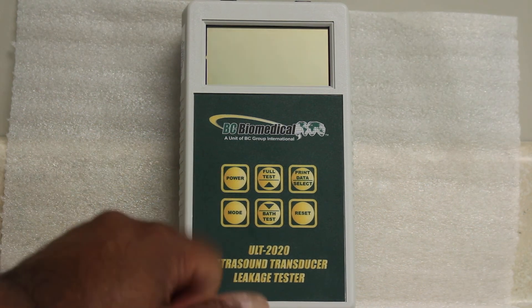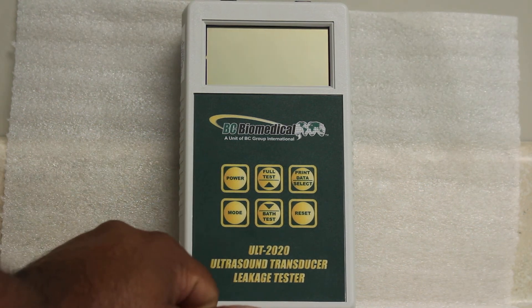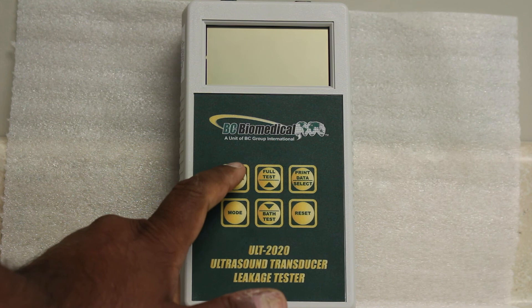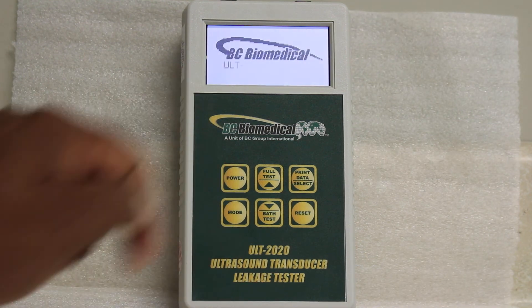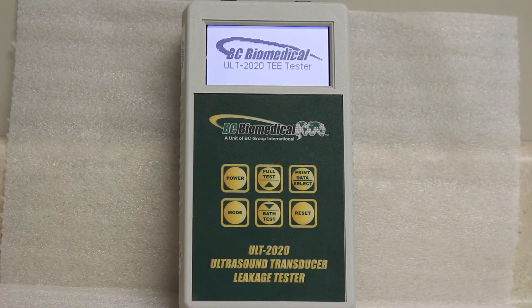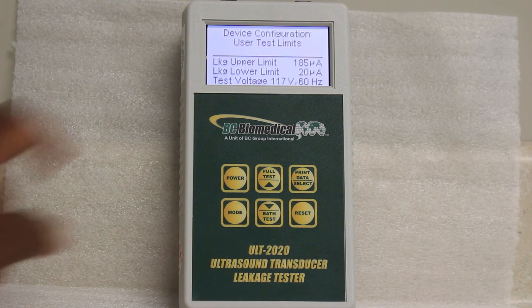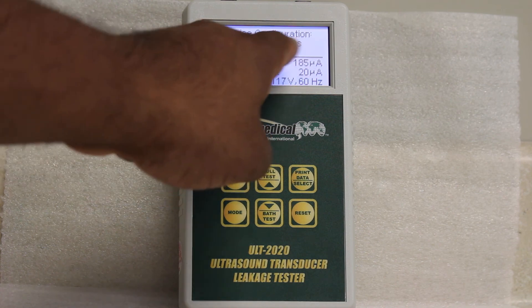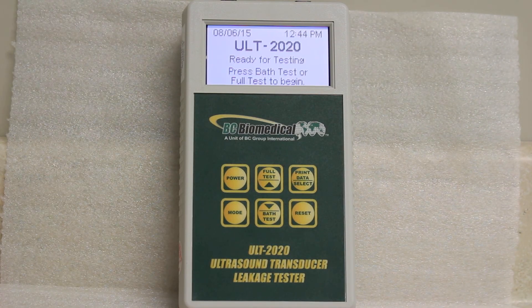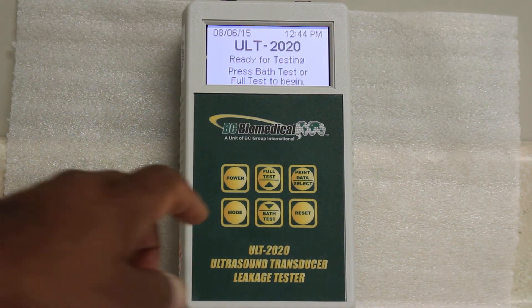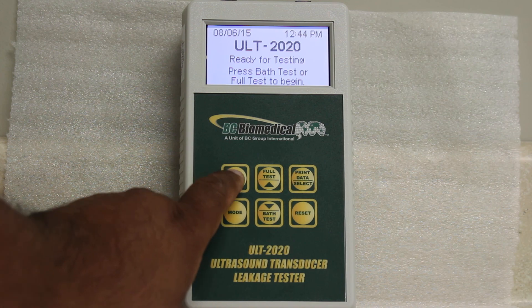Now we'll turn it off, and when I turn it back on again it will display what mode it's set to and what the leakage currents are. And again, it shows you user test limits: 185 and 20. That's it, thank you.